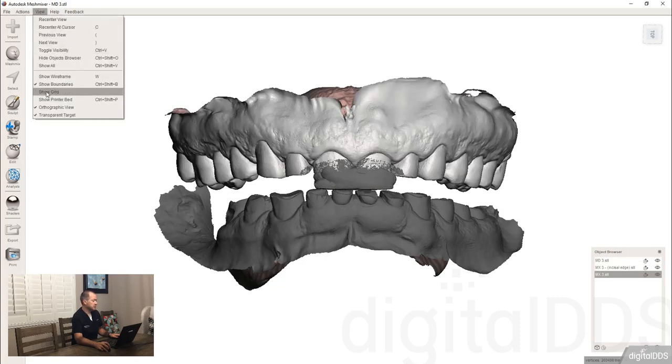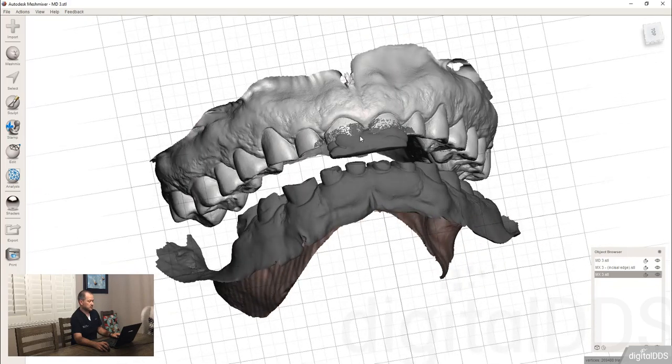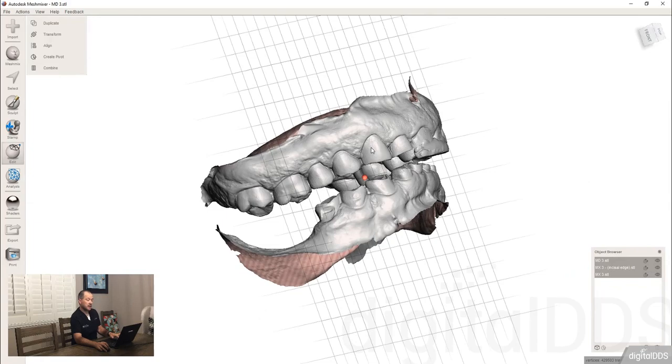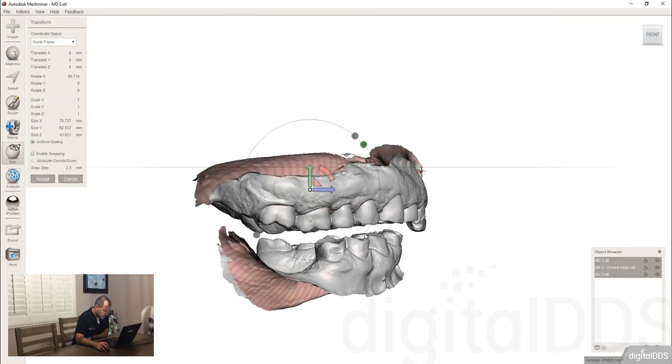Then I'll tell you that the plan on this patient is to establish an occlusal plane that aligns the teeth here in the back to this here in the front. Okay. And if you look, this patient is not aligned to the plane, so we'll go ahead and align it. In the end, I would recommend you base this model, but we're not going to at this point.